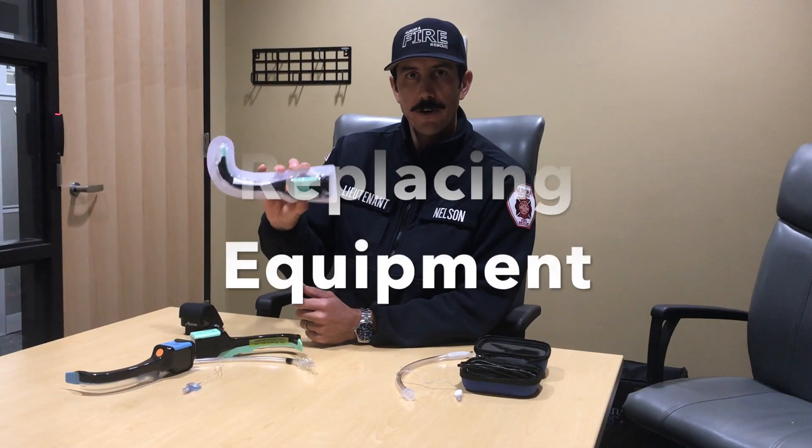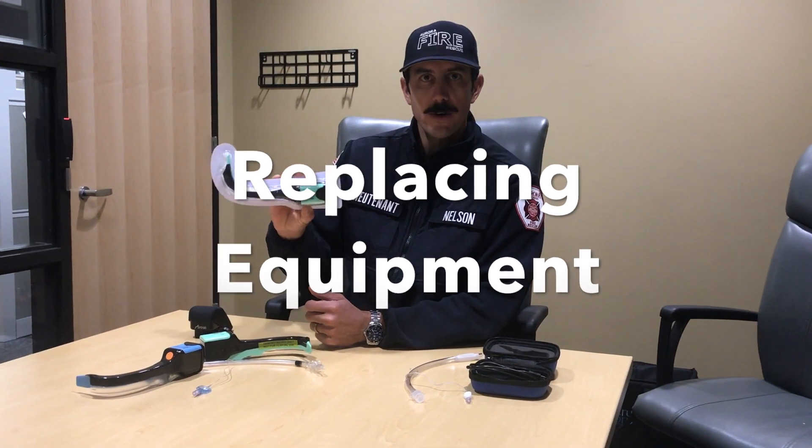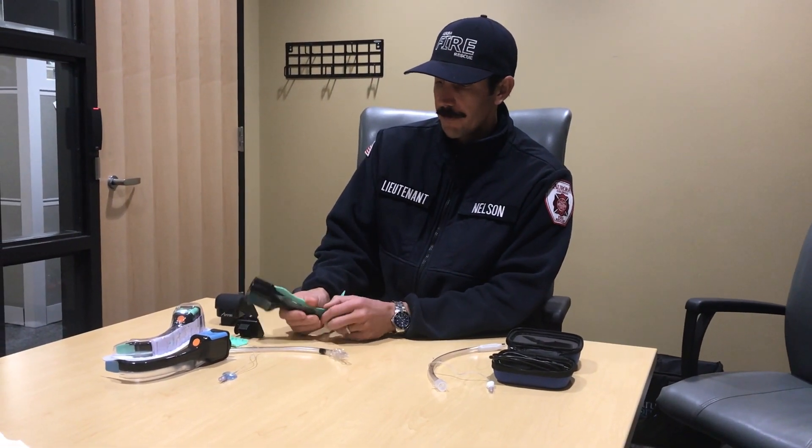Should one of these cameras get damaged in your kit or be lost for any reason, you fill out a loss and damage report through SharePoint to get it replaced. If you use one of these on a call, it can be replaced through Falk.